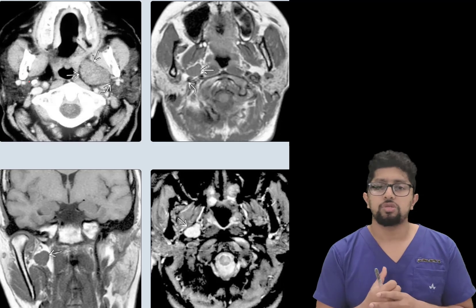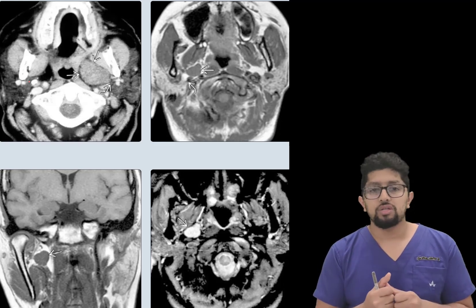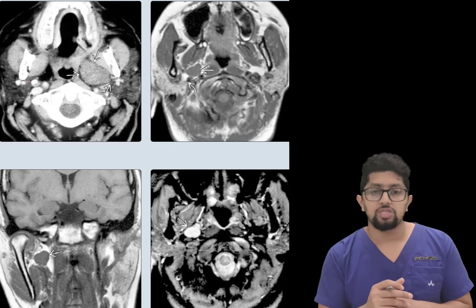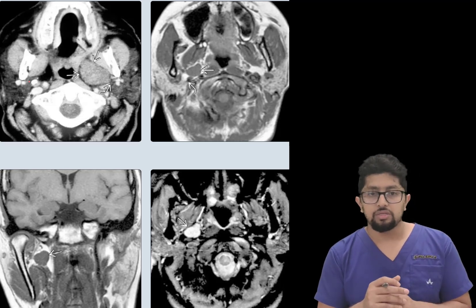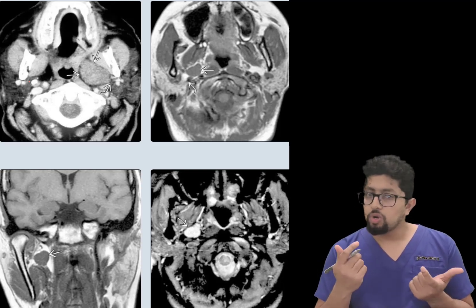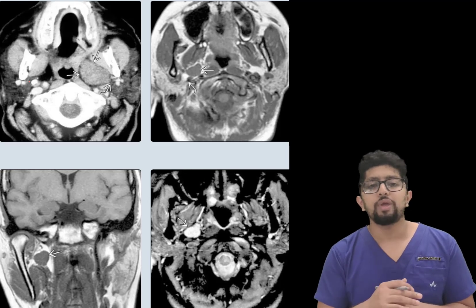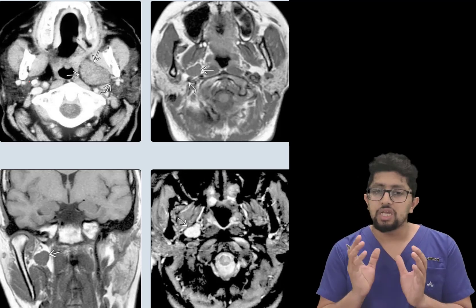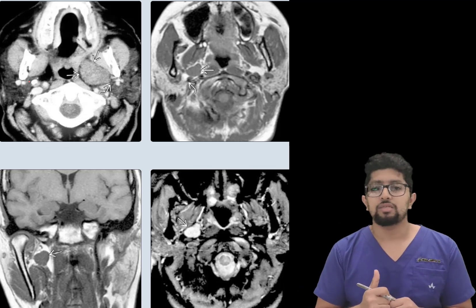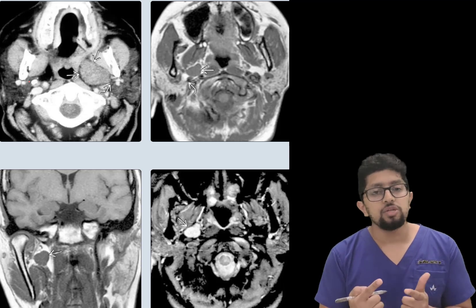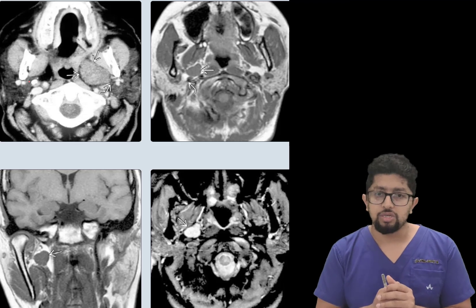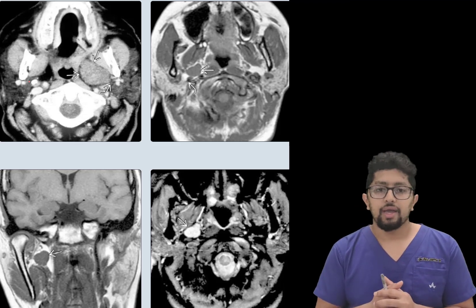The third lesion to differentiate is any form of cyst. A second branchial cyst is seen in the parapharyngeal space and also looks like a well-defined T2 hyperintense lesion, but on contrast enhancement there will be no enhancement. So, whenever we see a lesion in the parapharyngeal space that is very bright on T2, looks like CSF, shows heterogeneous enhancement, and is well-defined or slightly lobulated — that is pleomorphic adenoma.